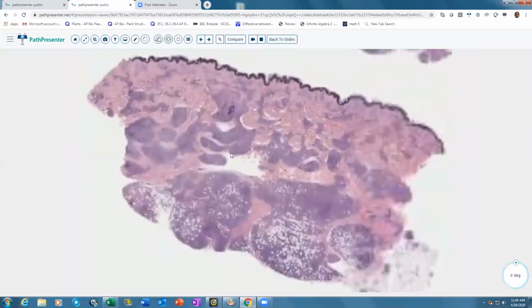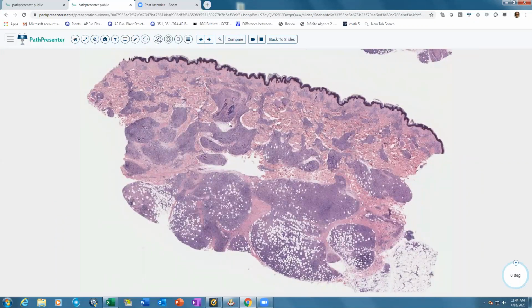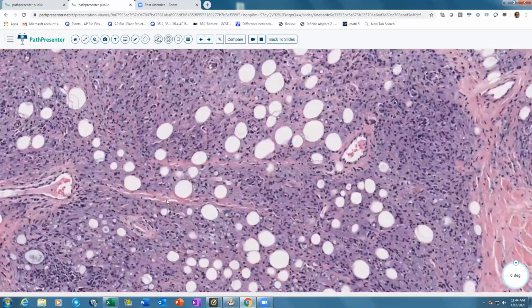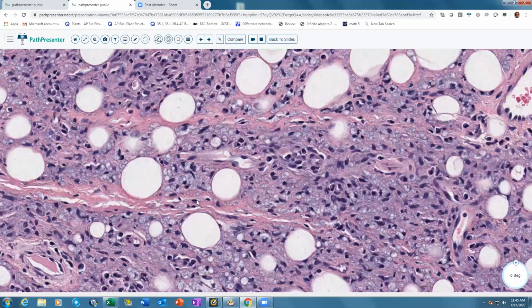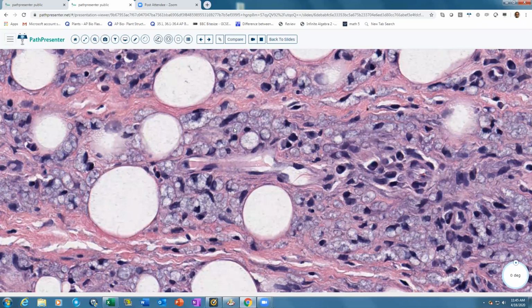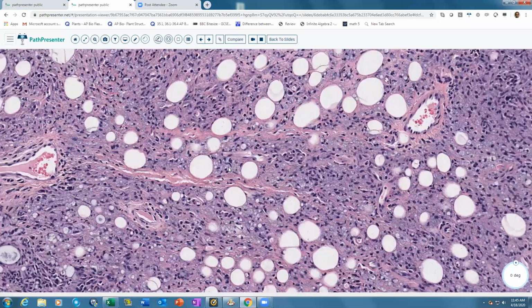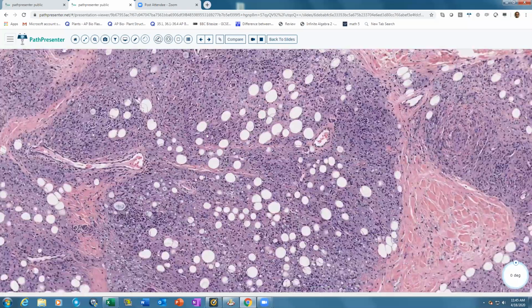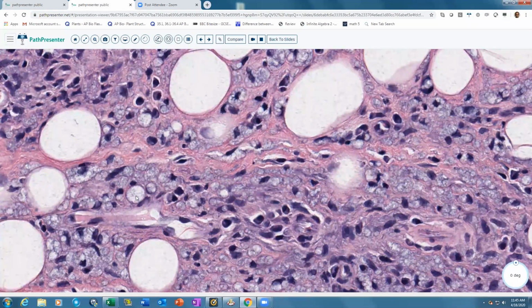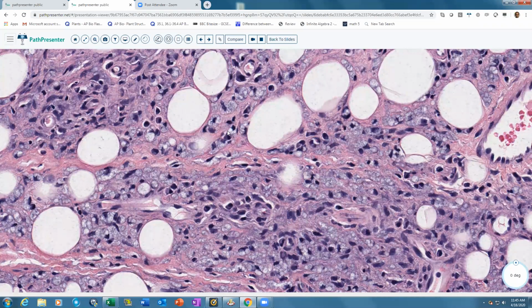When we look at a lesion here, this again has a lot of granulomas. You can see these granulomas look a little bit sarcoidal, but when you go high power and look at this granuloma, there are a lot of admixed lymphocytes. But within these macrophages, there's a lot of material here actually. So if you did a Fite stain, this would actually light up. So this is a lepromatous leprosy where you see these globi within the macrophages. So you can see a lot of these bacilli within the macrophages. They are all filled up with these bacilli.